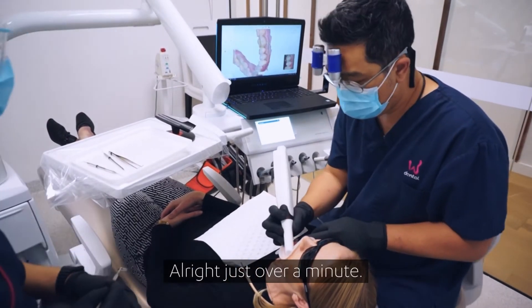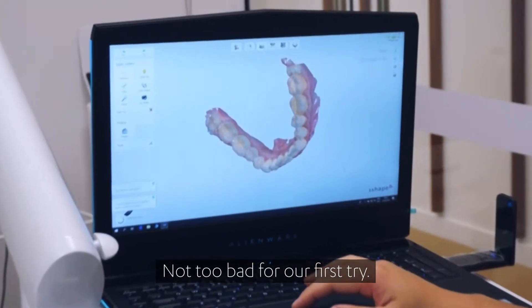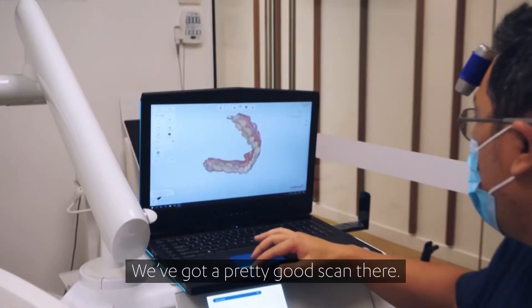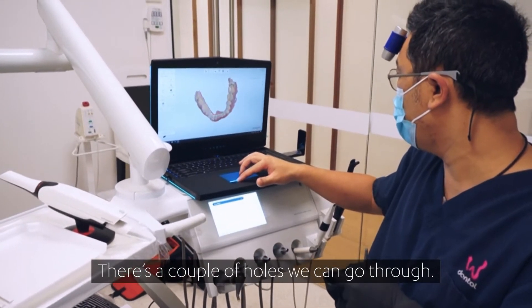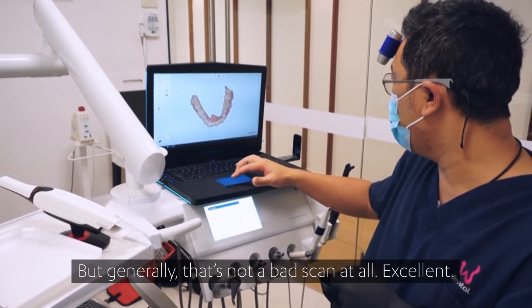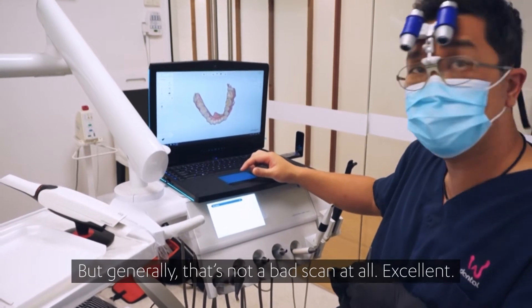Just over a minute — not too bad for our first try. We've got a pretty good scan there. A couple of holes we can go through, but generally that's not a bad scan at all.